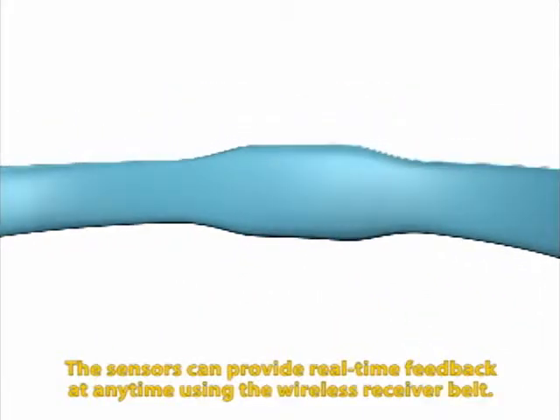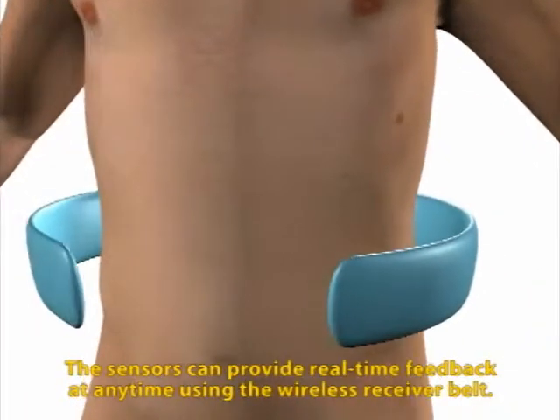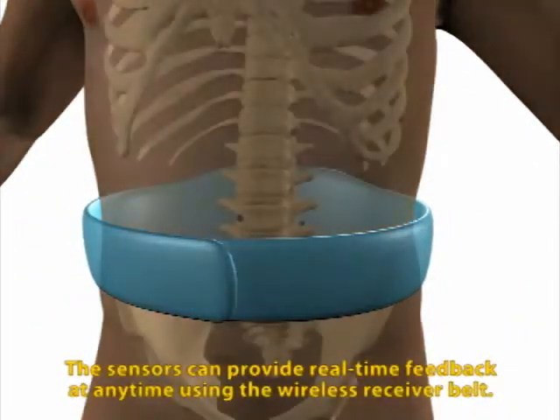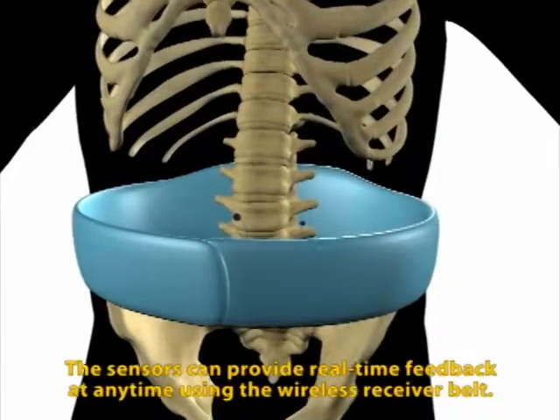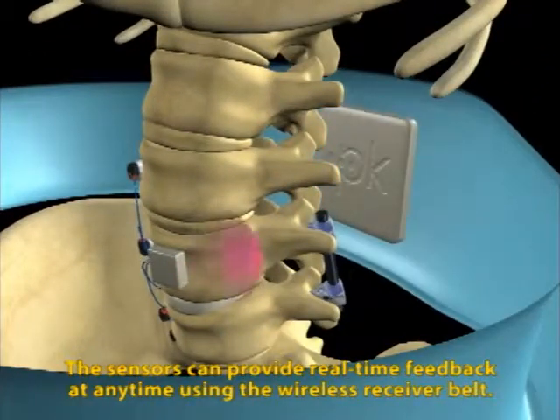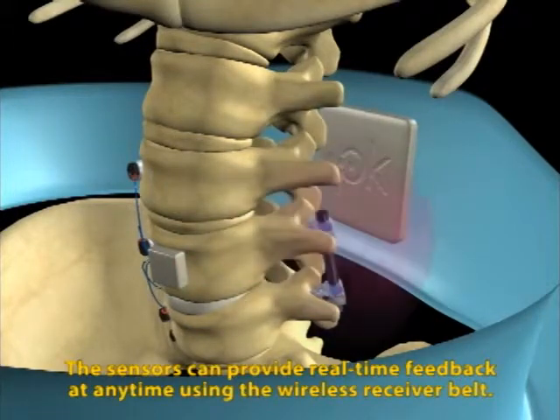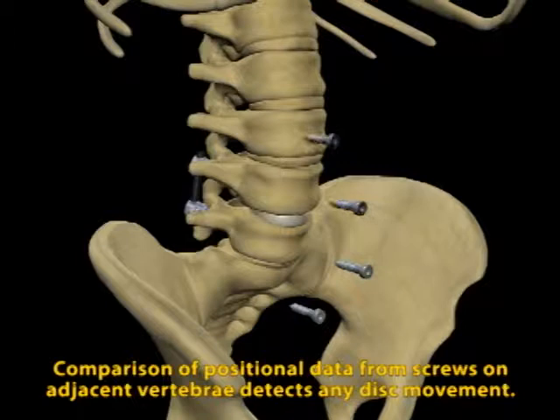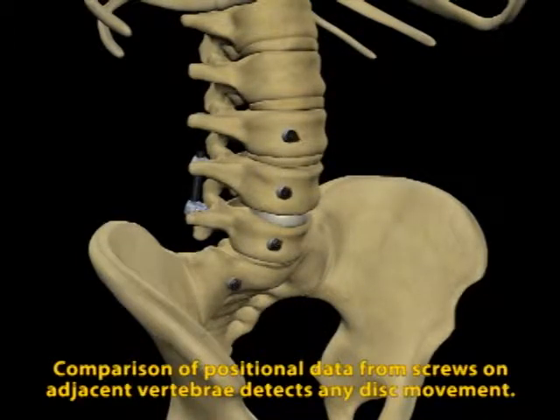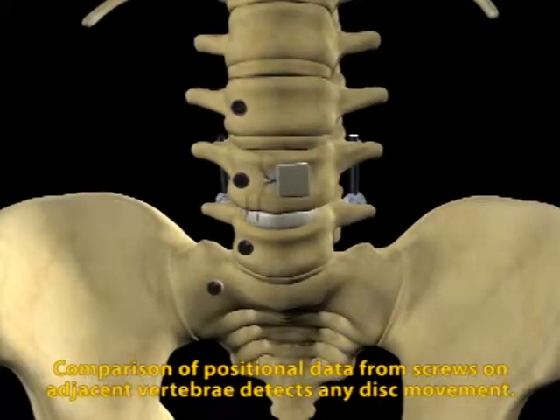When the external communication belt is worn, the device is activated via inductive charging and a sensor reading can be taken. The implanted processor allows information about the instrumentation to be passed on to the treating surgeon and the physical therapist, alerting them in the event of an unsuccessful fusion or a loose or broken screw. An accelerometer at the segments above and below will let the physician know over time if there is increased motion that may lead to stress and pressure on the adjacent segments, accounting for pain.